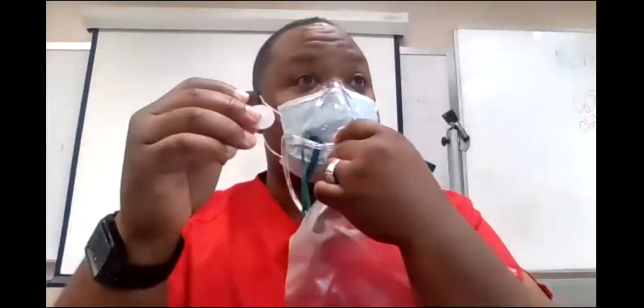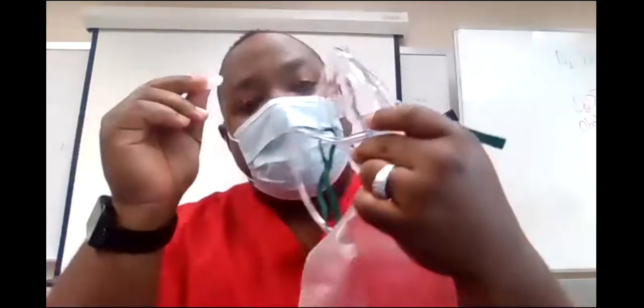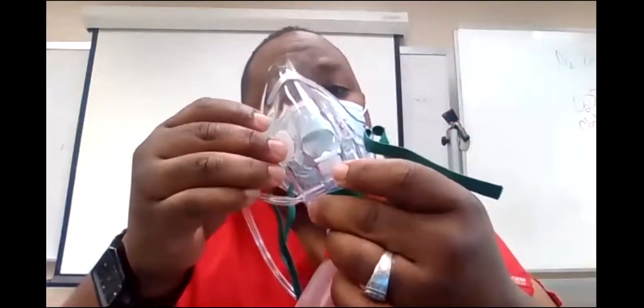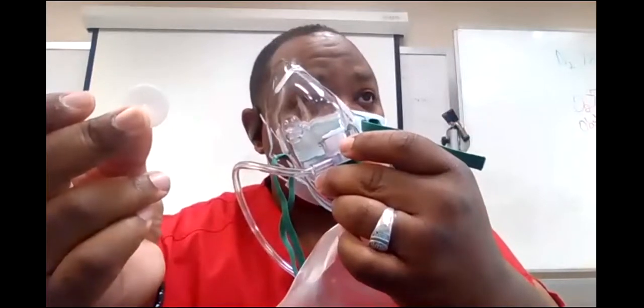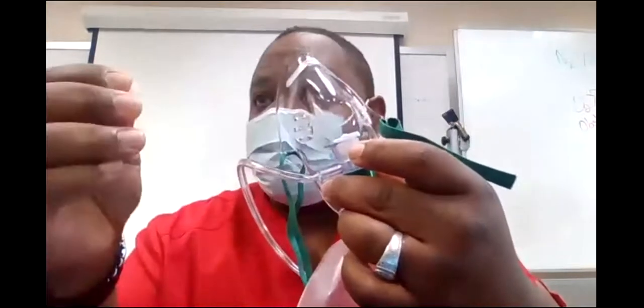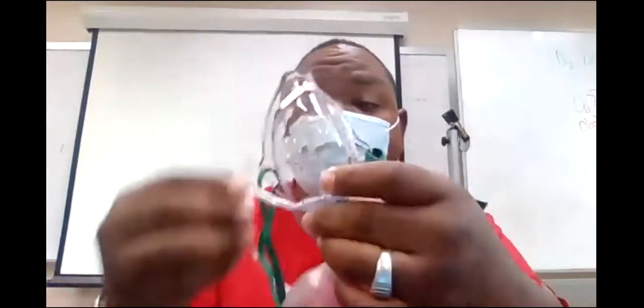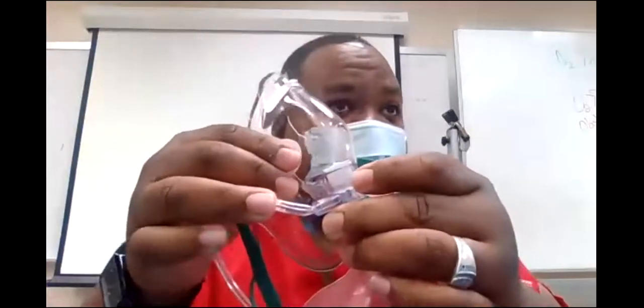And now when he tries to inhale, he's going to suffocate, right? Because these flaps are keeping him from sucking in. So when you buy them, they come together like this, but the manufacturer or the respiratory department will pull one off, okay? It's simply for safety. Just in case it gets disconnected, then you don't have to worry about it. They might not be getting any oxygen, but at least they're able to suck in some kind of air they can breathe, okay? So this is taken off for safety, all right?